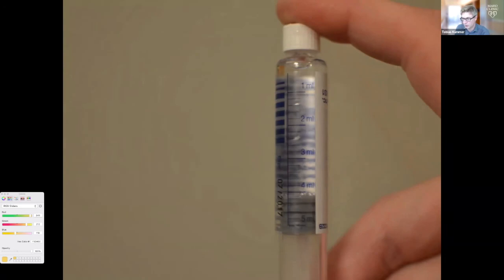So this is what contrast looks like when it's mixed up. It's nice, milky. If you put a lot of pressure in your hand, then it turns clear because all the bubbles get destroyed.